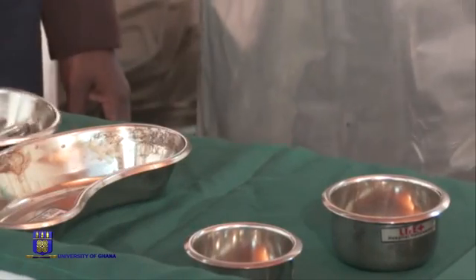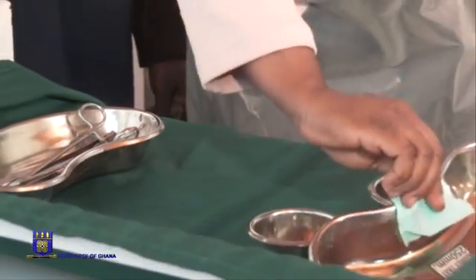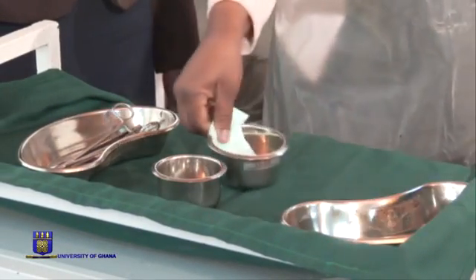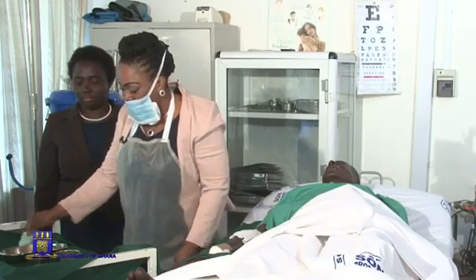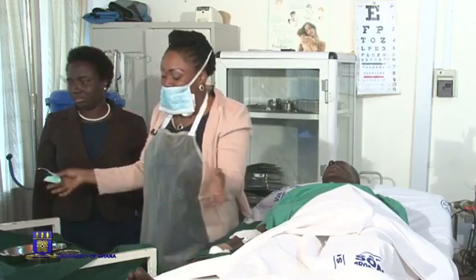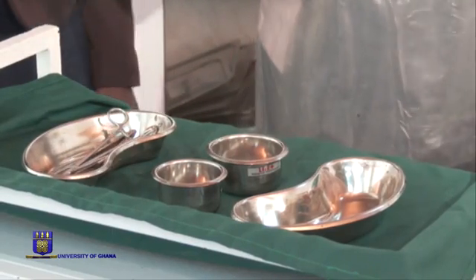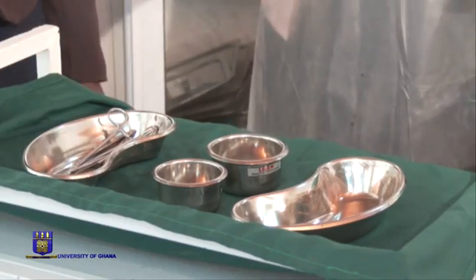So we have our instruments. The instruments should be arranged in such a way that they all face one direction. Nursing is an art. So our two receivers or kidney dishes will be on each side of the trolley with the gallipots in the middle or in the center. And then we have our dressing forceps.